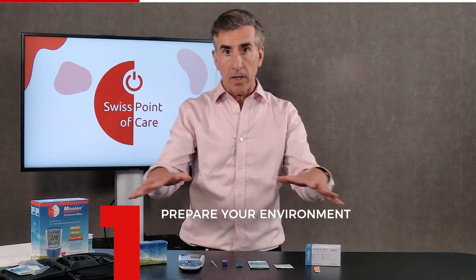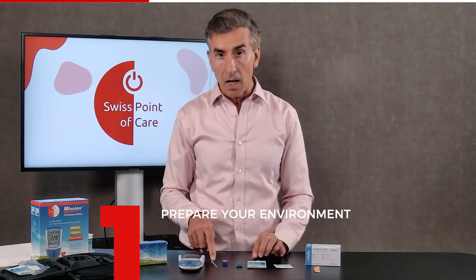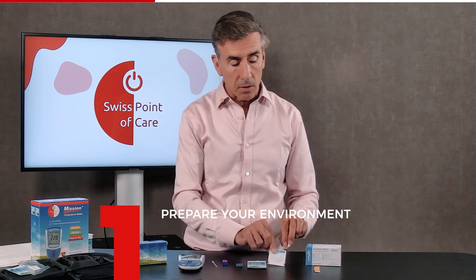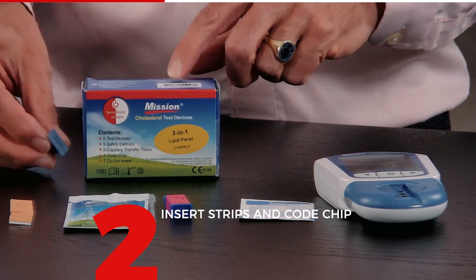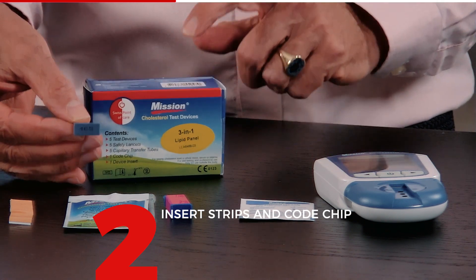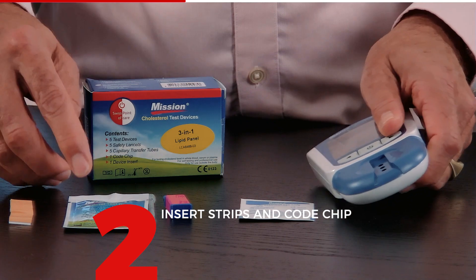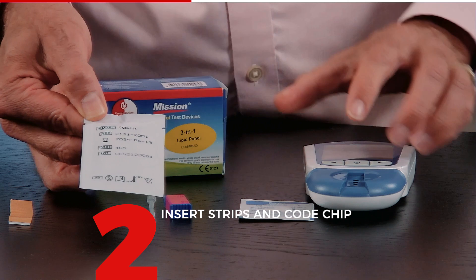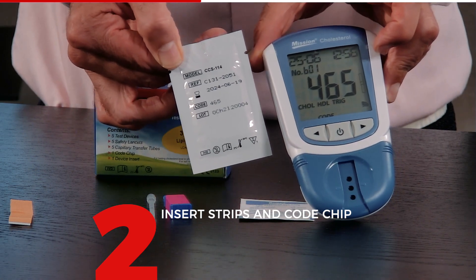Now I'm going to show you how to do a test. Make sure you have a bit of space on a free table with not too much clutter, and make sure you have everything before you start: the meter, the test strips, the safety lancet, the capillary, an alcohol wipe to clean your finger, and a small plaster for after the prick. In every box there is always a code chip with calibration information, so the device is automatically calibrated. Make sure that with every new box you put in the new code chip — the number on the chip corresponds with the number on the sachet, for example 465, and the meter will confirm this number when turned on.